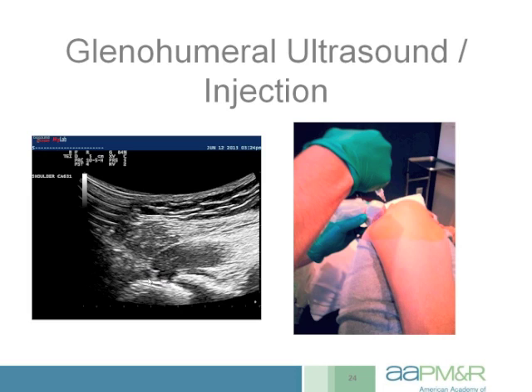Now in someone without an effusion, you'd essentially be needing to land right in this area at the back of the joint, as there's going to be minimal posterior distension of the capsule. In the case of a patient with an effusion, basically once you cross the capsule here into the effusion, you're going to have a successful intra-articular injection. This shows a photograph here of what this looks like. So this is the patient's front, the patient's back, the probe in the axial plane, and the needle coming in here lateral to medial.